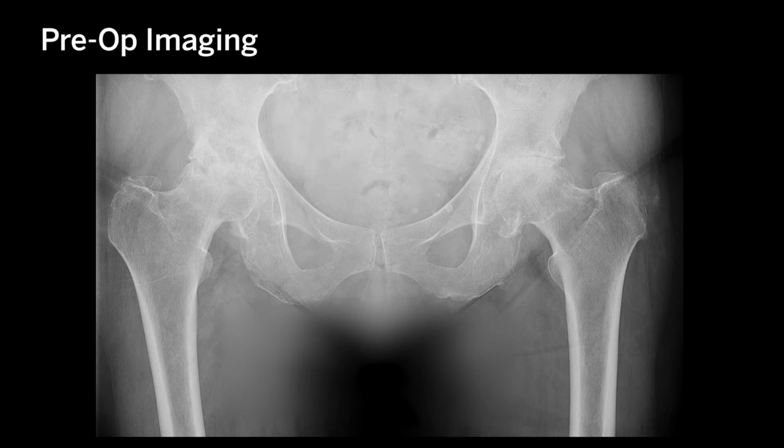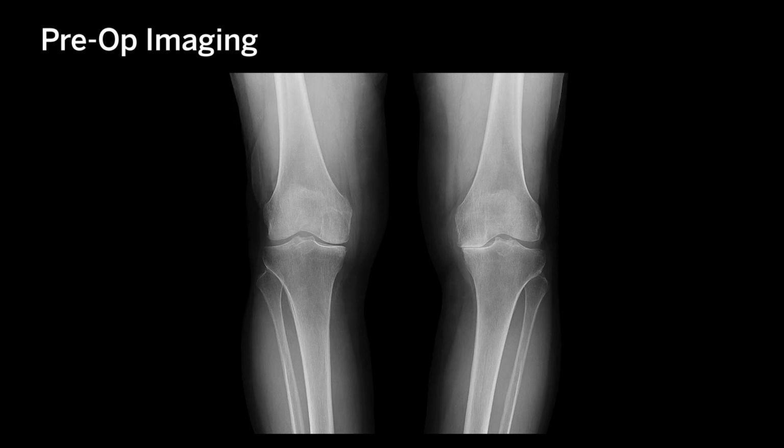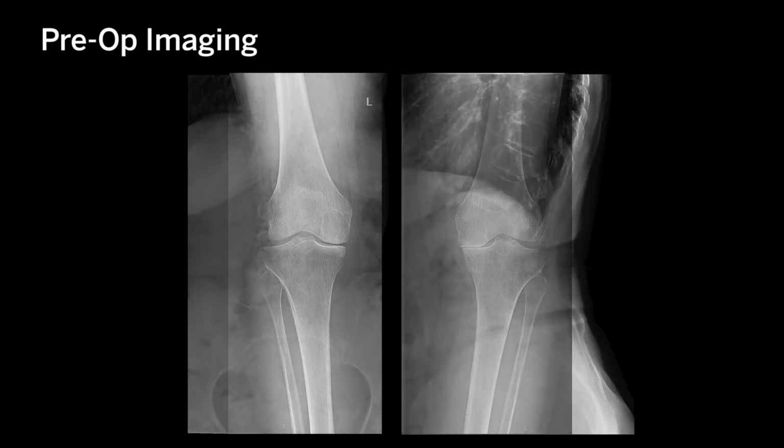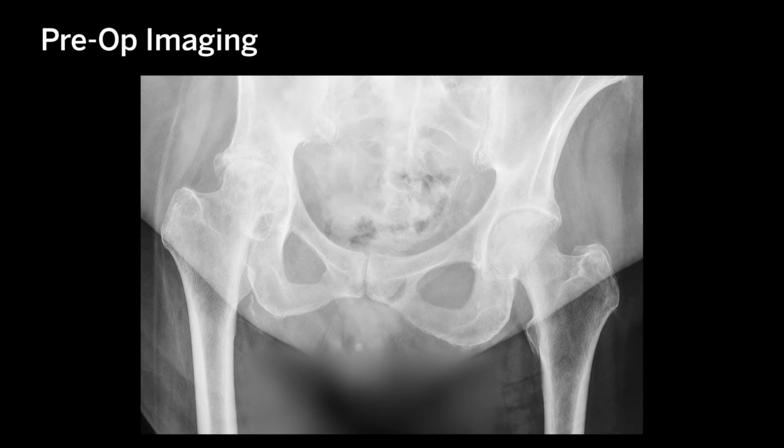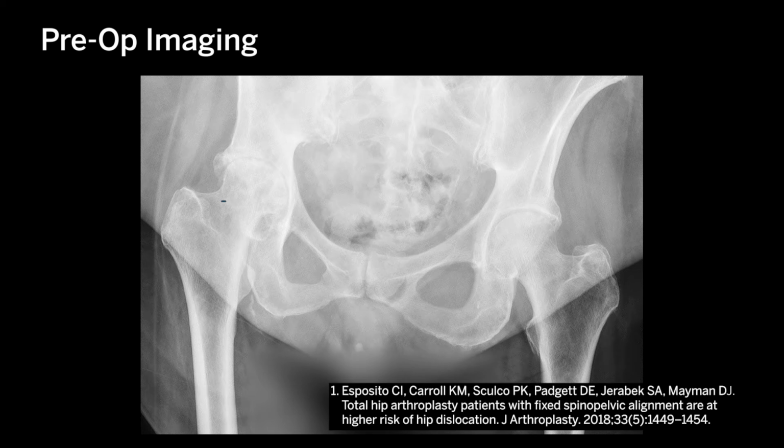Our preoperative imaging includes a true AP of both hips, AP standing of both knees, as frequently the hip pain will radiate to the knee, an AP and lateral of the lumbosacral spine. If you are confronted in the operating room with a pelvic tilt without available x-rays of the lumbosacral spine, you will not be able to determine whether the pelvic tilt is secondary to a severely adducted right hip or to a lumbosacral pathology. Likewise, if you don't have a lateral view of the lumbosacral spine, you can't assess lordosis, kyphosis, mobility, and all factors which could influence the position of the acetabular component. Such information is essential to do an adequate preoperative planning.